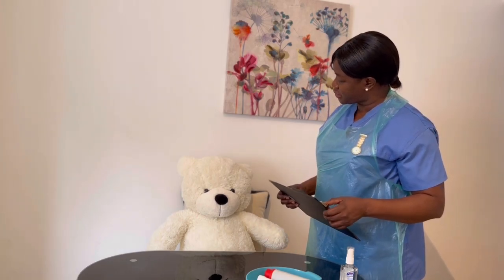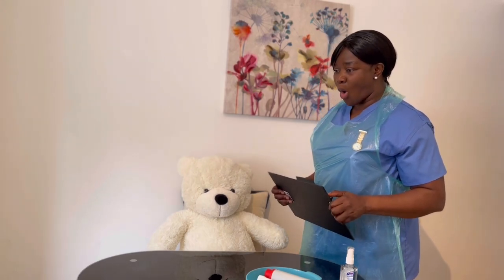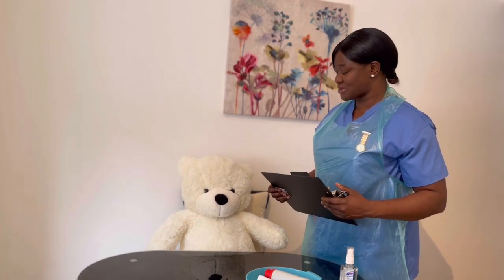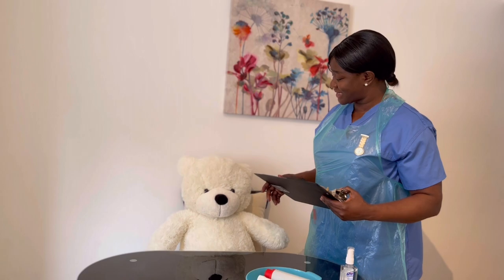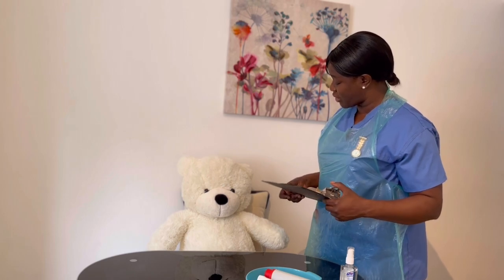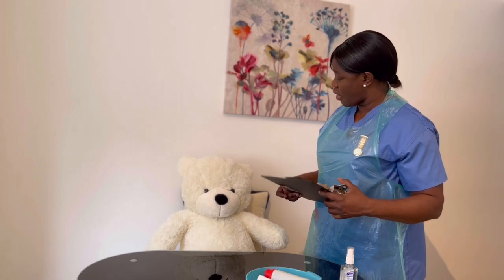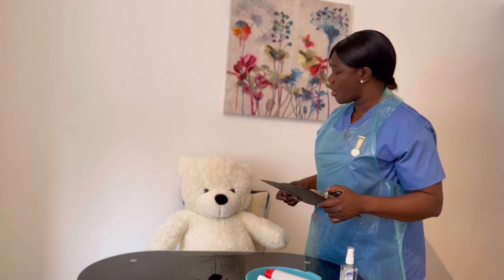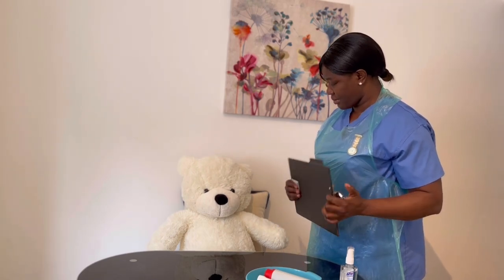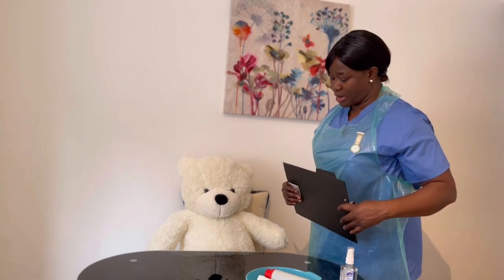Harry, I just need to check with you — have you been taking your peak flow reading before now? Yes, nurse. What's your best reading? I believe it to be 600. That's wonderful. I'm here just to take a peak flow reading and see how well you're doing. Are you on any inhaled medication? Yes, I am. Are you asthmatic? Yes. So I'm just going to explain what you need to do. Is that okay? And you told me you are comfortable and not in any pain. Okay, wonderful.